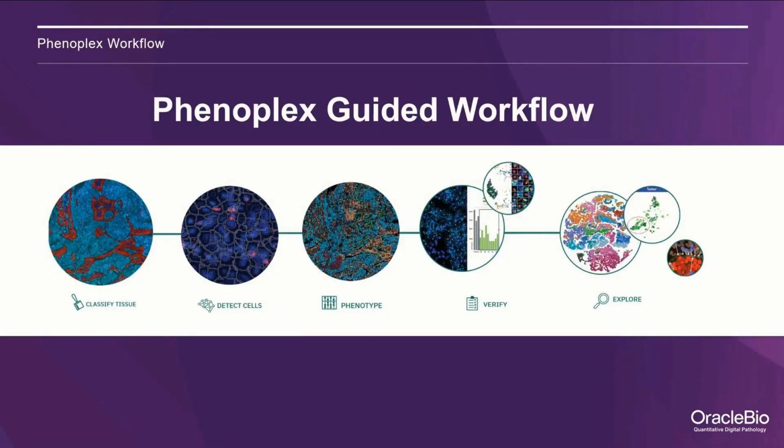Here we use a recently added module within Visiopharm called PhenoPlex. The PhenoPlex module allows the user to dynamically choose and set thresholds per marker channel, as well as to verify created phenotypes and explore the data for visual trends and insights. Now, before I jump into the module, I'd like to highlight another thing we like about working with Akoya images is the addition of an autofluorescence channel.